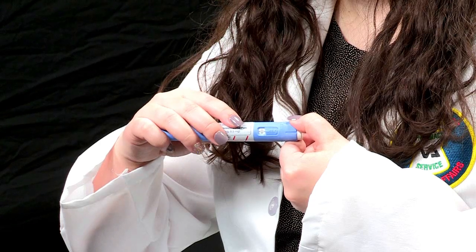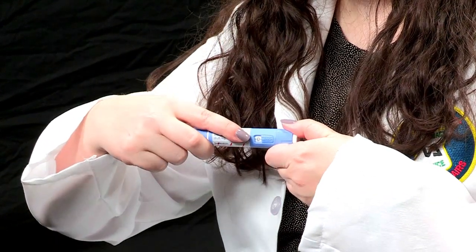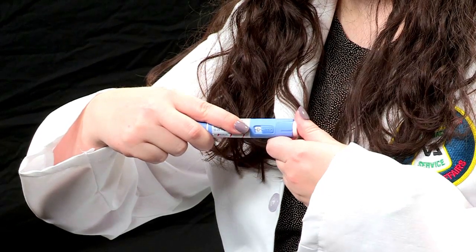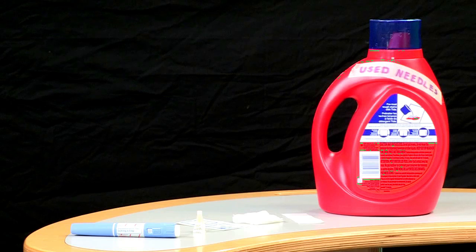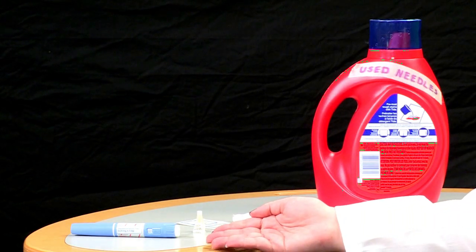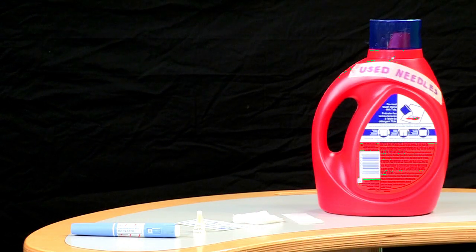The pre-filled pen has a dial so you can select the dose. Note the pen window, dose counter, and pointer, the dose selector, and the push button. The supplies you will need for this injection include your pen, a pen needle, and a sharps container. If you do not have a sharps container, you can use a heavy plastic container such as an old laundry detergent bottle. Please make sure you write 'used needles' in bold letters on the side.